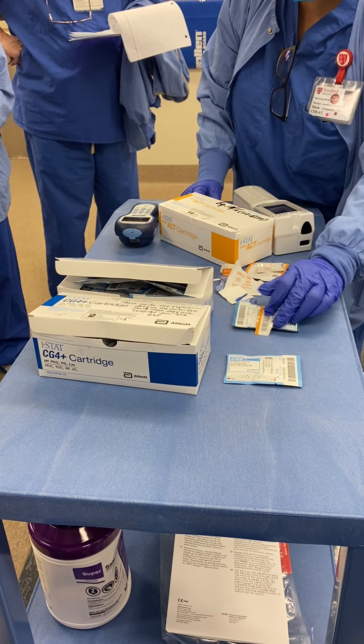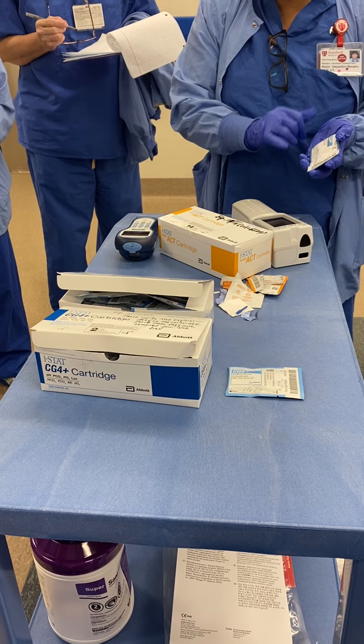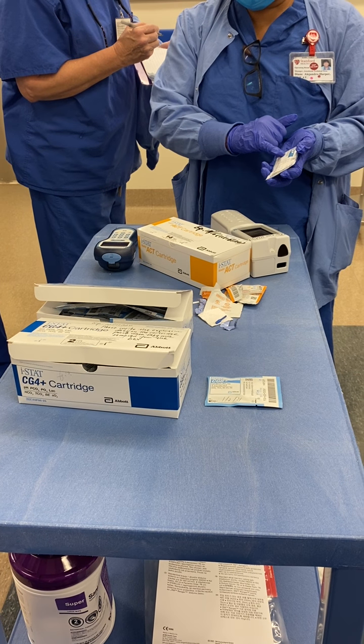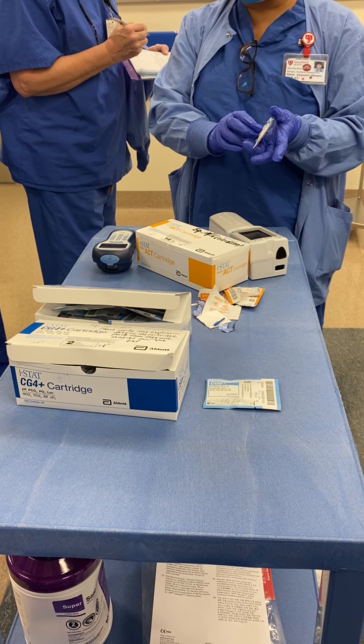And then this one is CG4, and the way you know what it does is it tells you in the cartridge: pH, PCO2, PO2, lactate, HCO3, TCO2, SO2. You might have no idea what this is. I'm going to go over it with all of you.